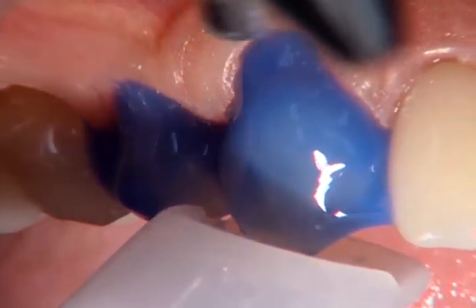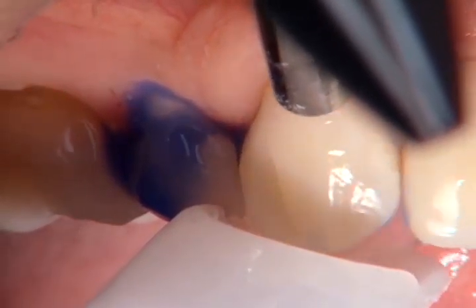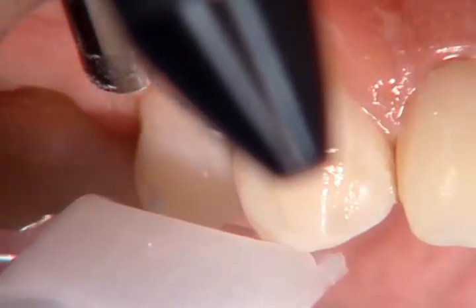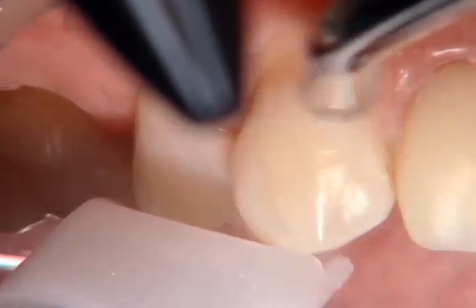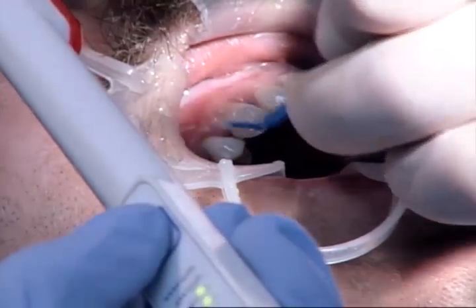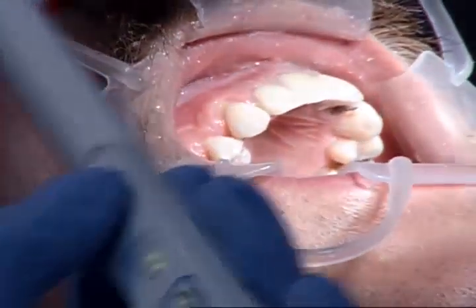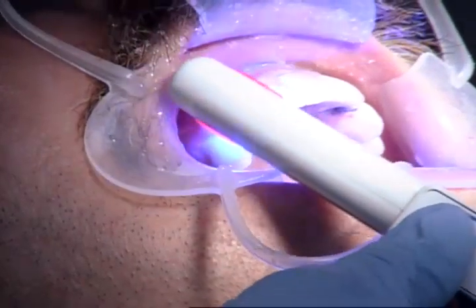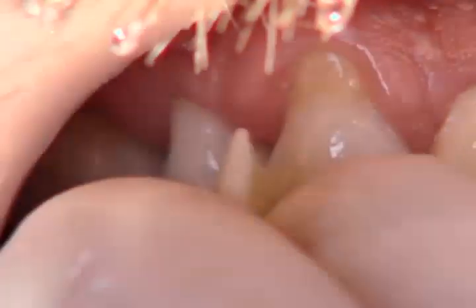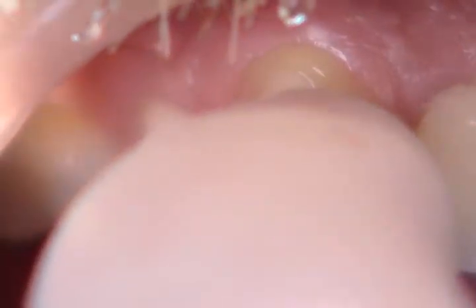And as we're all familiar with, or most of us anyway, those of us who are as old as I am from the old days of rinsing off the etch from the enamel and being able to air dry it and see that frosty or chalky look. It's kind of fun not to be bonding to dentin, even though there is a little root surface there on that tooth number 6 that you see on the cuspid. It's fun with these veneers not to have to worry about dentin and keeping it moist and all those kind of concerns, post-operative sensitivity concerns. It's nice to just be bonding to enamel again.